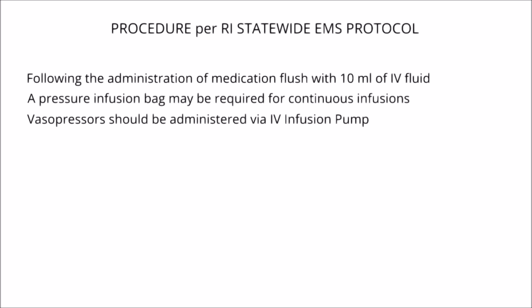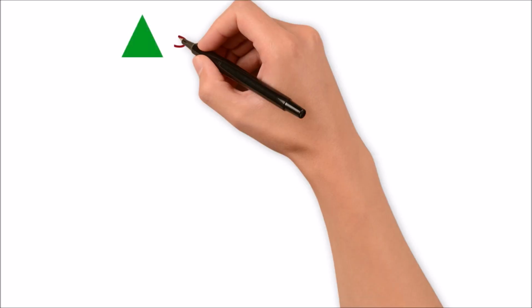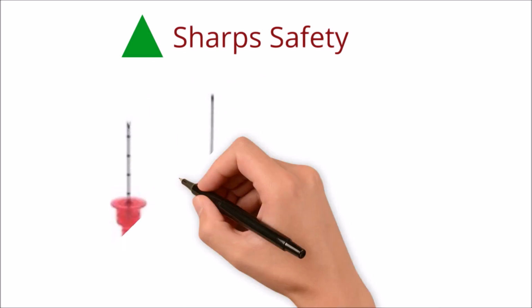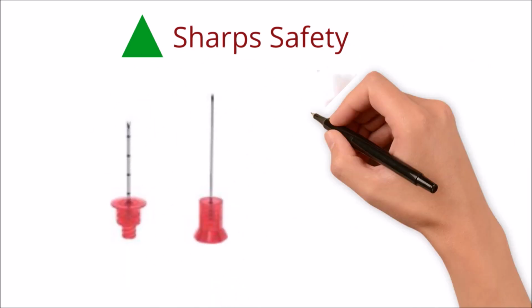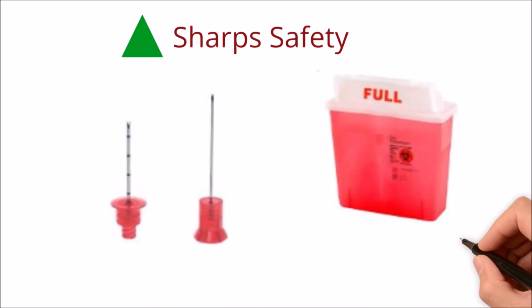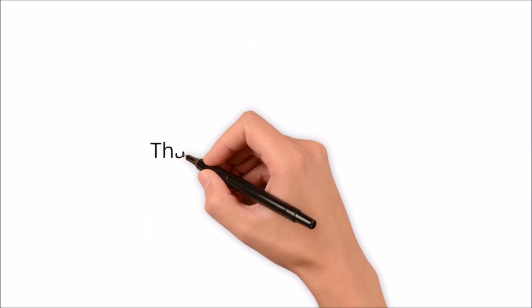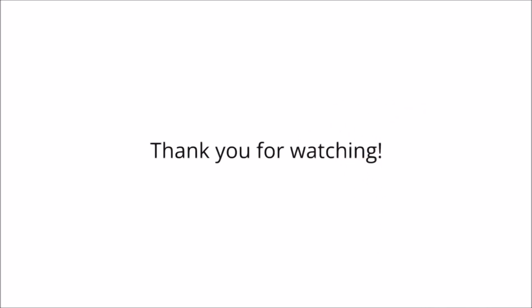The needles utilized in this procedure are quite large and can cause hazard to the patient, provider, or bystanders. Make sure as soon as you pull the needle out, you stick it in a sharps container. Thank you for viewing this presentation. If you have any questions about intraosseous needle placement or the specific device your service uses, see the manufacturer website for specific instructions on use, or reference the Rhode Island Statewide EMS protocols.